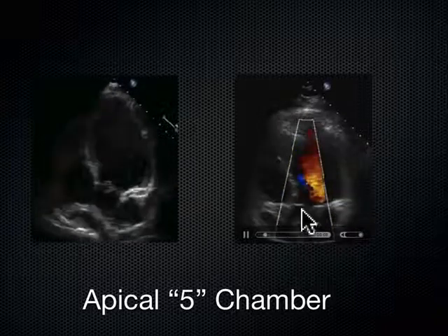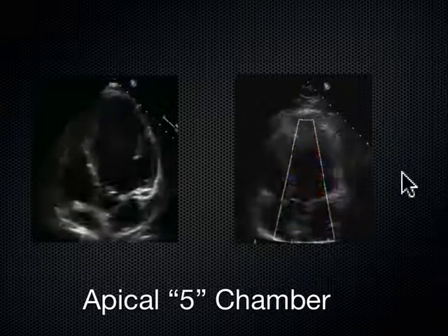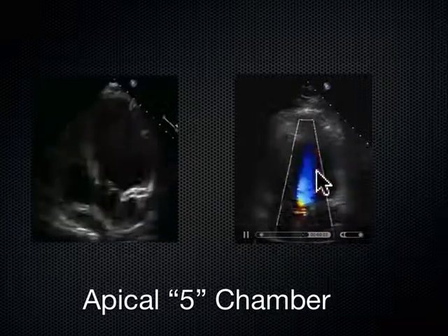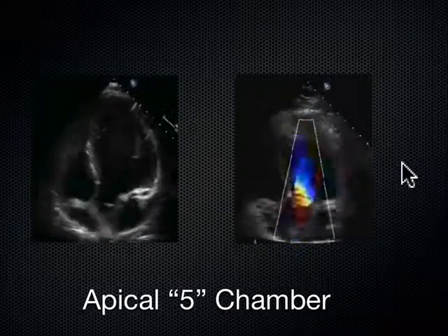If we get a red towards, well, then the blood is regurgitating back across that aortic valve and back into the left ventricle. So that's why there's a little aortic regurgitation coming out of the aortic valve just right here. That's what that red is, red towards. So this person has some aortic regurgitation.